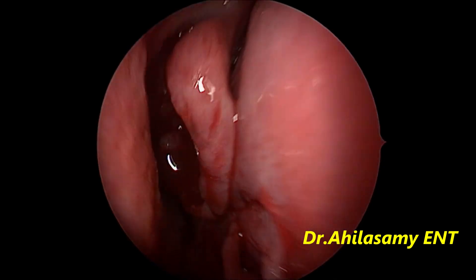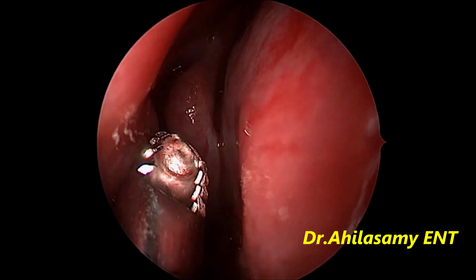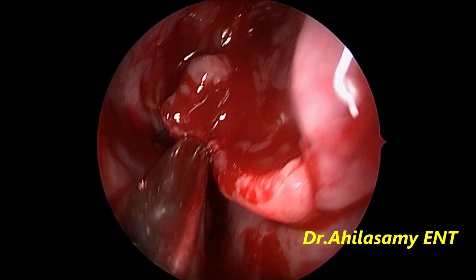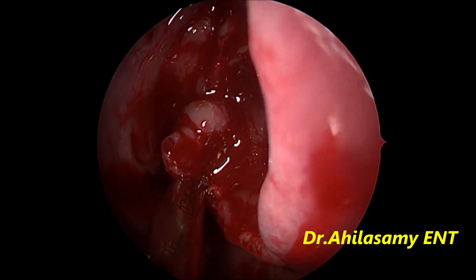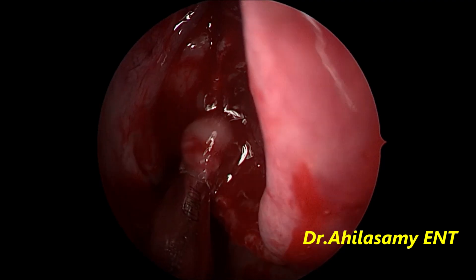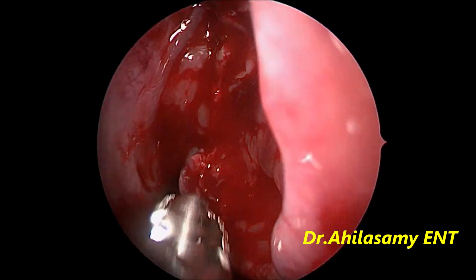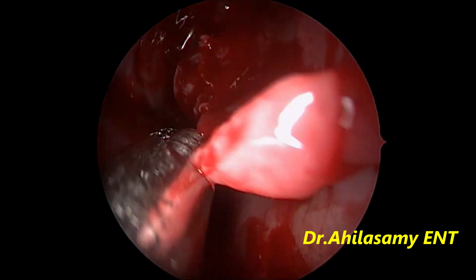There is a septal tear also made by my assistant doctor. Anyway, it happens sometimes, but do not have a through-and-through perforation.